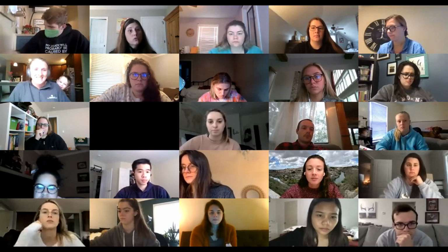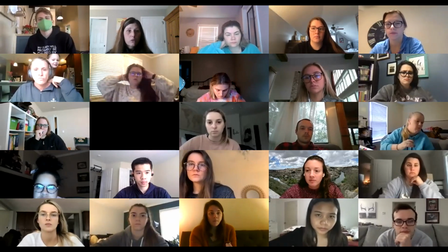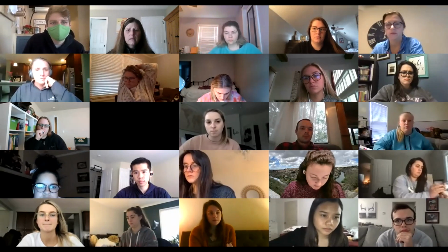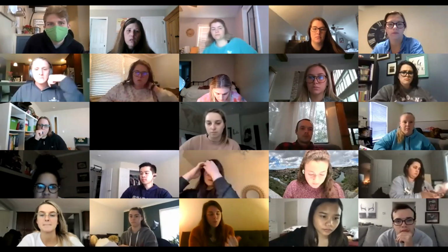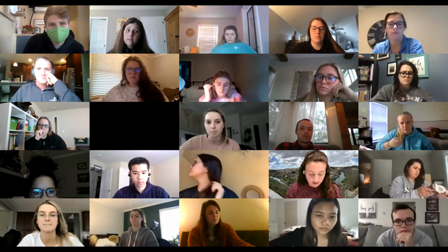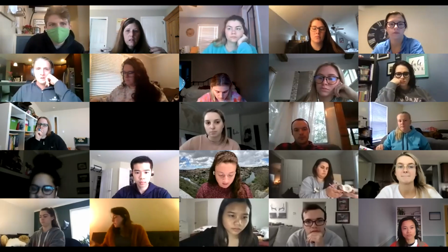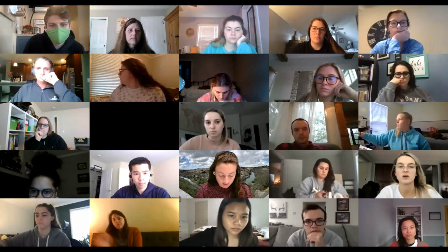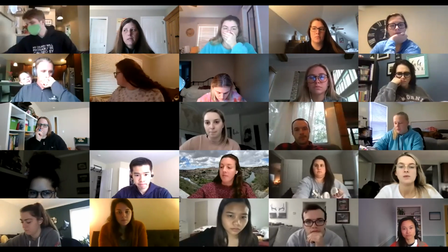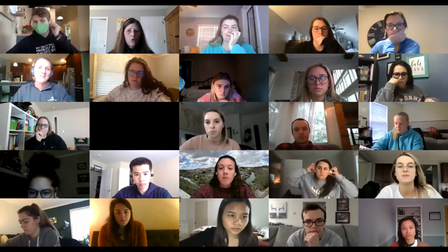I've inserted some strips so you guys can see some examples after we go through what the definition of a particular dysrhythmia is. So that hopefully will be helpful to you, as well as a few other things. As Jane and Janie said earlier today, this is not an anatomy class. So I'm going to just touch on a couple of things to hopefully refresh the anatomy and physiology that you had, but we're not spending a lot of time on it because you should already come into this course with an understanding of it. Just for the sake of talking about some of these things, I'm going to touch on it very briefly here in the very beginning. I have a few pictures to go along with that as well.